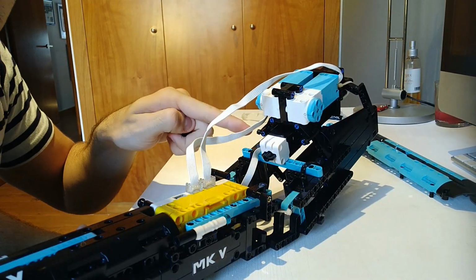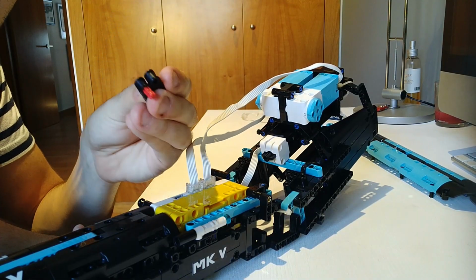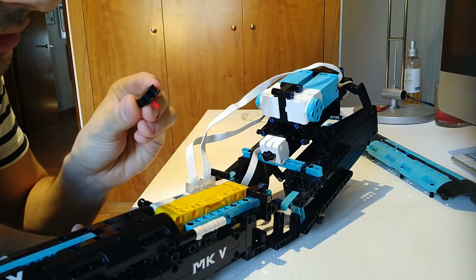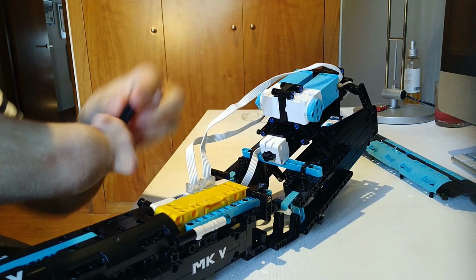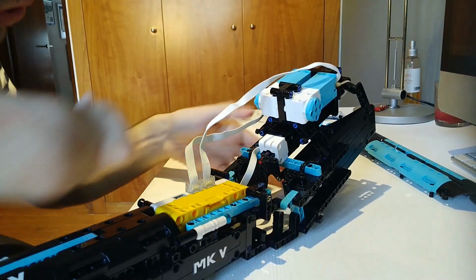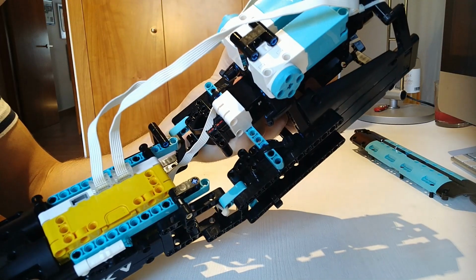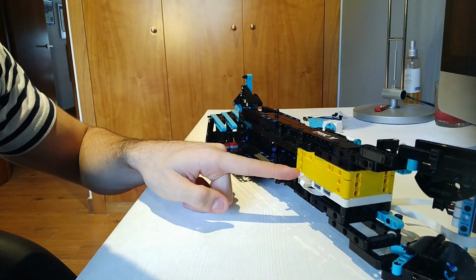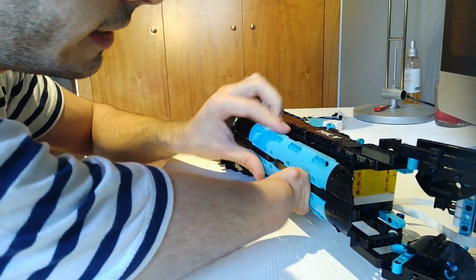Okay, once you finish this, you need this brick right here that was floating in the instructions. And there's a text that says that this is going to be connected to the pressure sensor. So you need to connect it right here. And it should look like this. Let's take a closer look. Now that we have the hub connected to the pressure sensor, we need to put this on the prosthetic again.